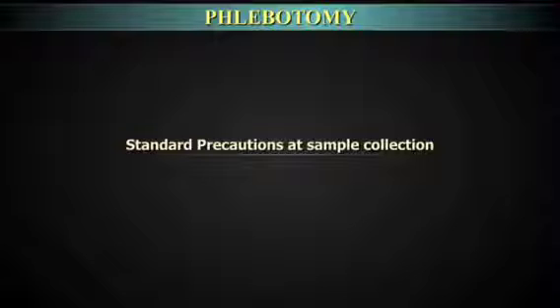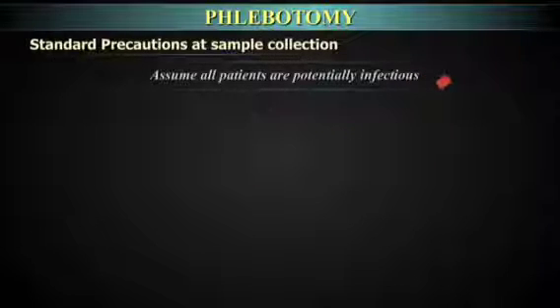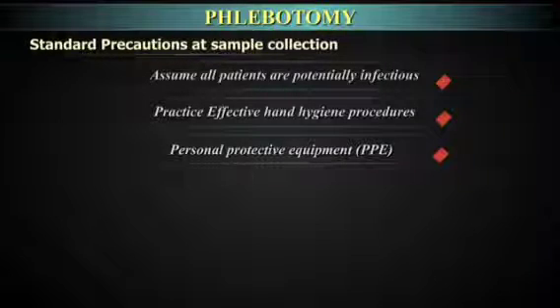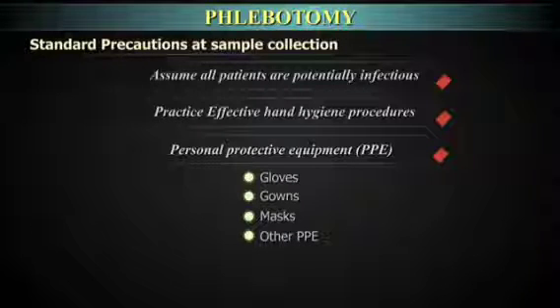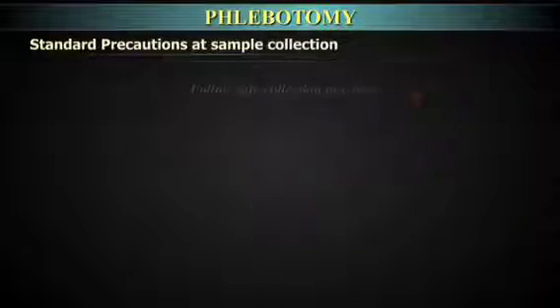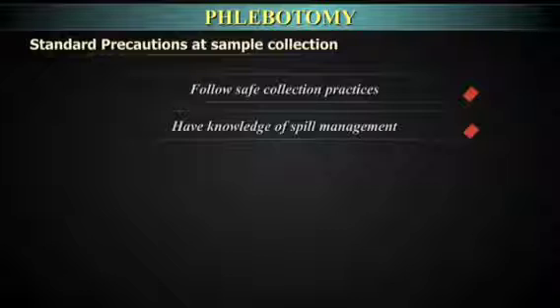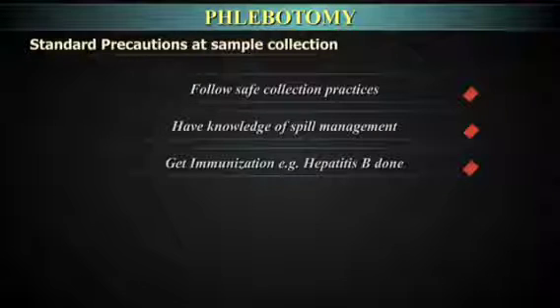Standard precautions at sample collection. Assume all patients are potentially infectious. Practice effective hand hygiene procedures. Wear gloves during the procedure and use lab coats, masks, and other personal protective equipment wherever indicated. Wear closed-toed shoes or boots. Follow safe collection practices. Have knowledge of spill management.